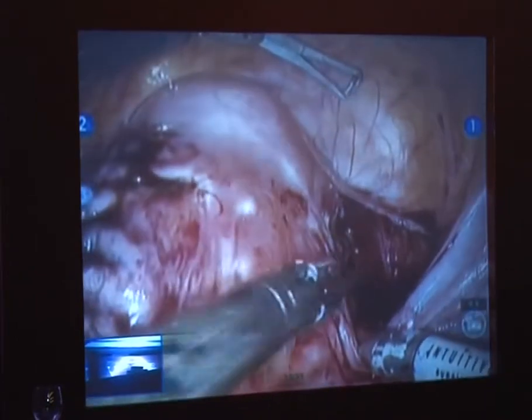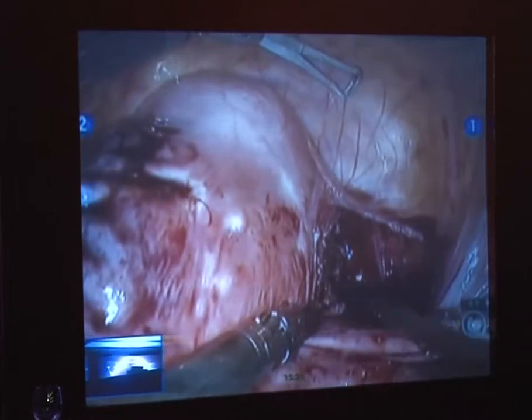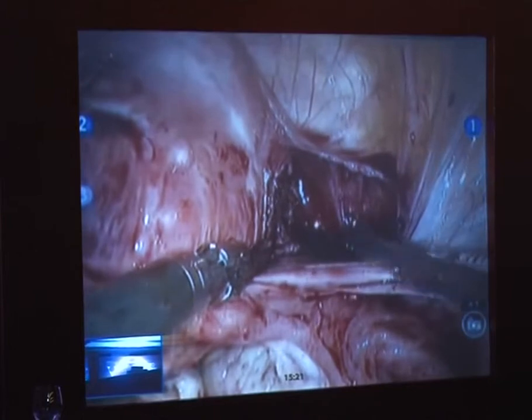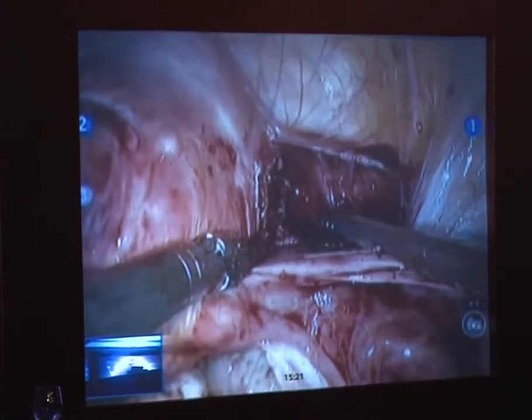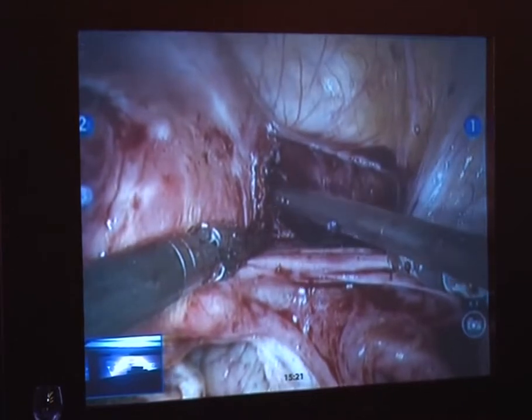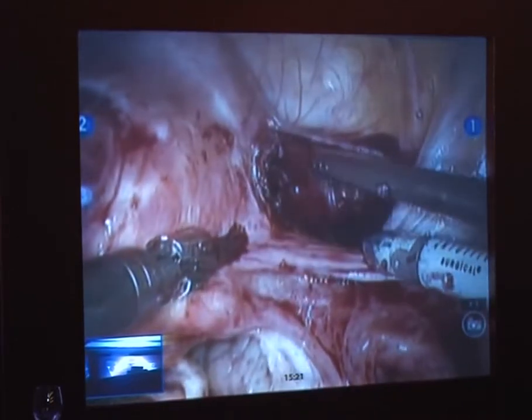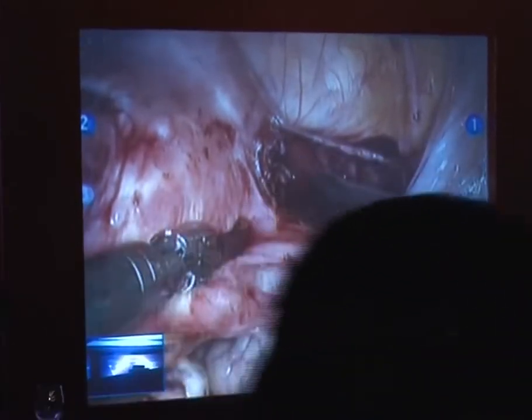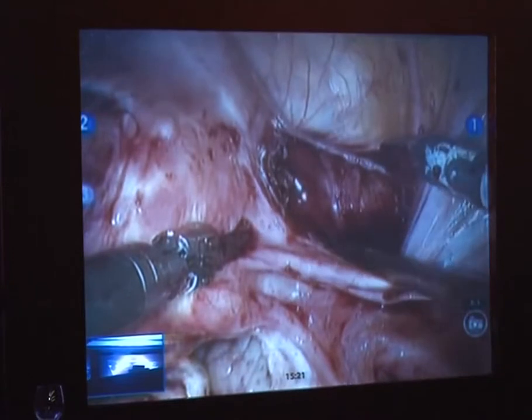This is just a little bit of, that's the serosa. It's got a little bit of fluid in there, but that's okay. That's all closed off. It's going to be hemostatic. I think we're good. What we'll do now is, let me see this here. Let's see if this is another myoma here. This might be another fibroid, actually.